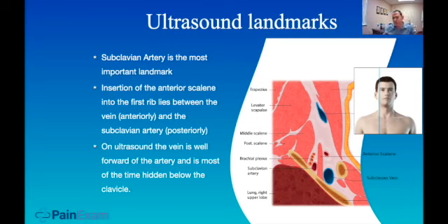So this is what I call the hybrid view, meaning it looks like it's an interscalene, yet it's sort of a supraclavicular. So I'd say it's more of a supraclavicular. However, the nerves here are lined up like interscalene. Nice, you have your ducks in a row right here. So it's kind of that transition point, I call this. When you're doing the interscalene and supraclavicular, it's not going to look like this. This is really that mid zone between the two blocks. Or you actually may be in the interscalene region if you look at my line over here, but you're just not angling the ultrasound to see it in that fashion.